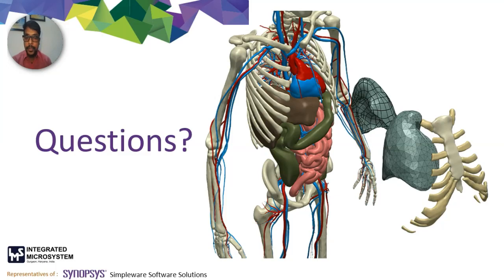So if you are working in batches of knee images, you can utilize those modules for doing automated segmentations by just importing the data and doing the segmentation completely automatically, and later on exporting it for 3D printing purposes or simulation purposes or surgical planning purposes.